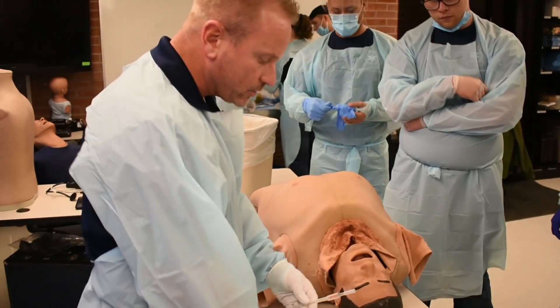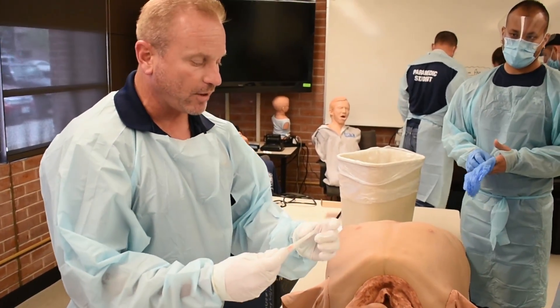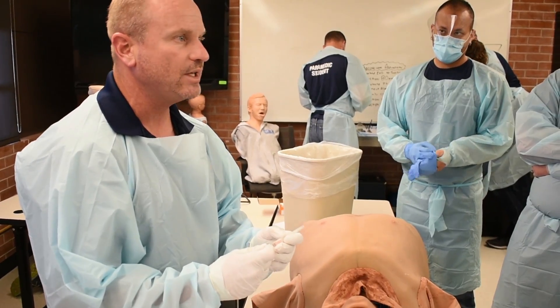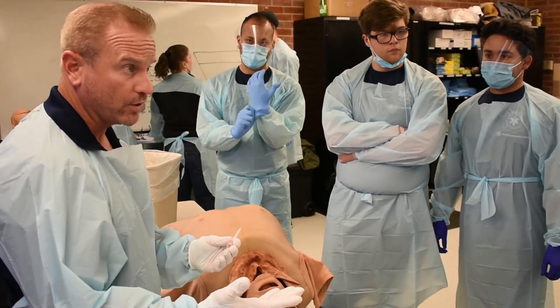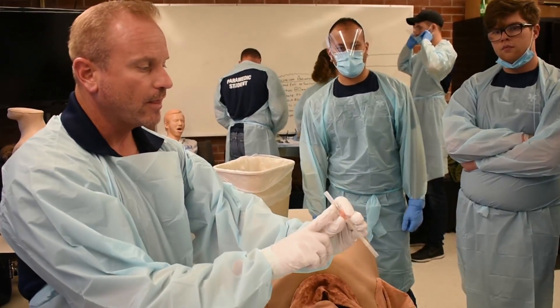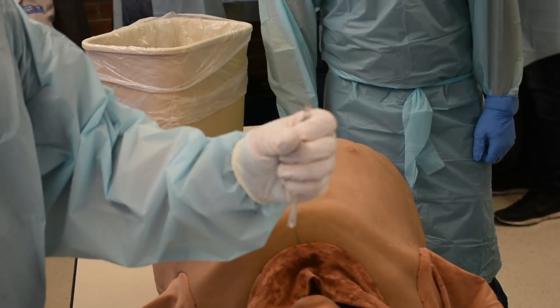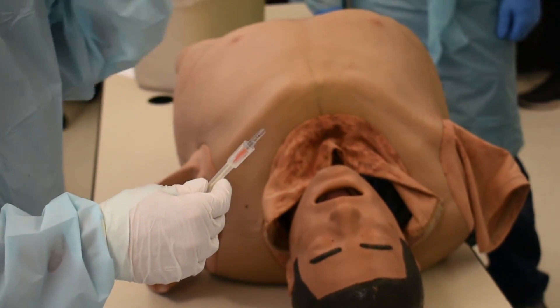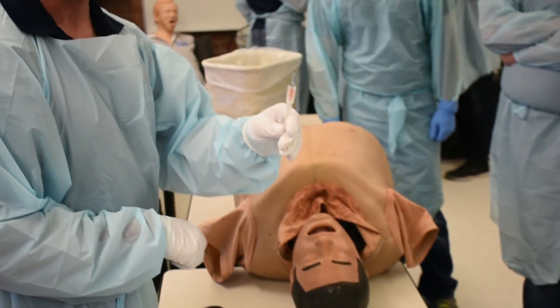I use an ARS needle — an air releasing system needle. It's a 14 by 3¼. You want to use a 14 gauge by 3¼ inch catheter, or a 12 gauge by 3¼ inch catheter. You need the length. Most of the 14 gauges come with a backing on it. This will not release any air until you pull off the back. So you can also get the ones called ARSs, air releasing system — it just doesn't have this back on it.